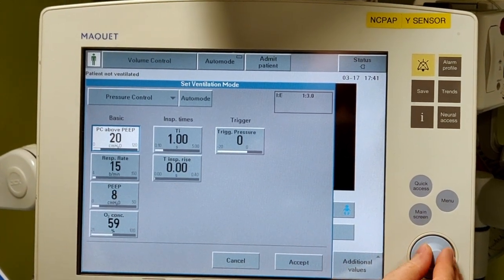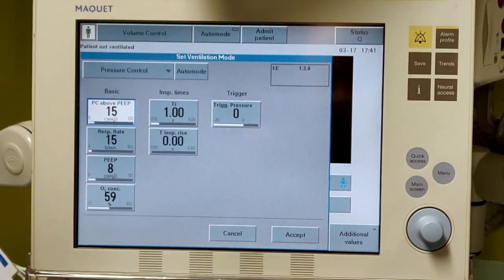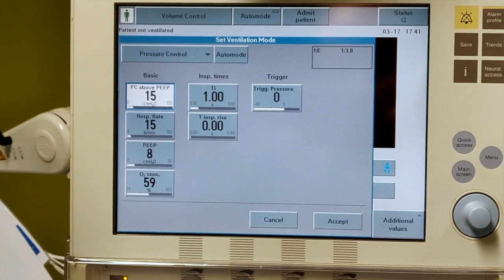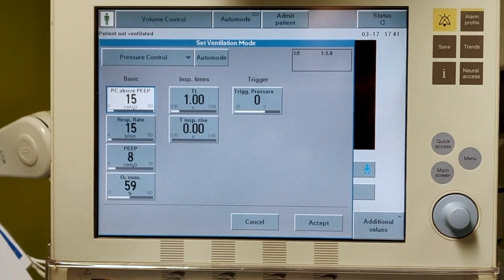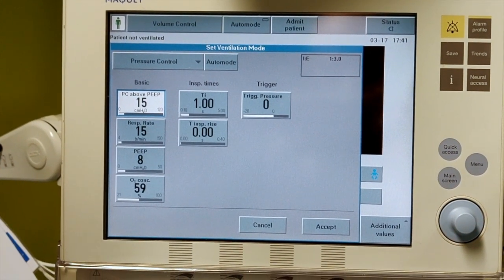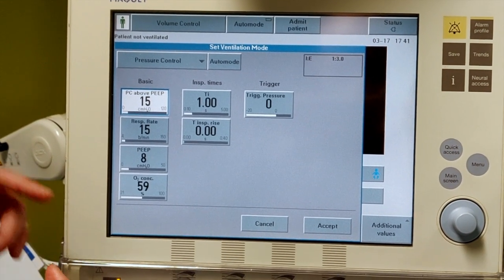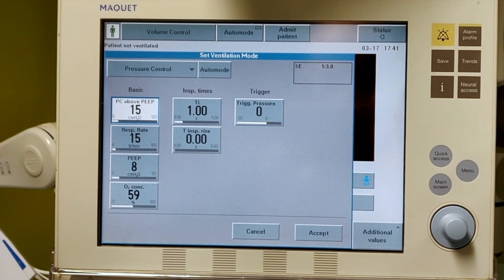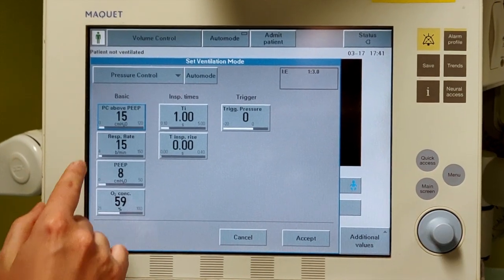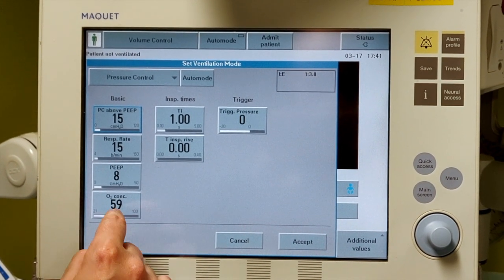There's a lot of literature saying that patients that have pressures above PEEP, and ventilate well with that, below 15, are better. There's a lot of talk about the injury of the shearing effect of high delta P's, high differences in pressure. The problem is that we don't choose our patient. We need to try to optimize our ventilation to achieve this, but actually sometimes it might not be possible. So we're going to start with 15, and we're going to see if this is correct or not. It depends on the volumes we are getting on our readings.